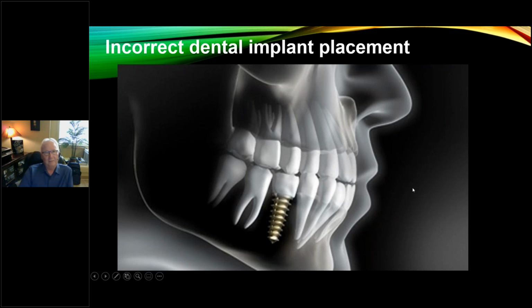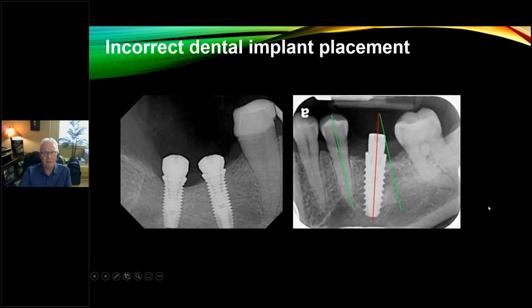All right, incorrect implant placement again, and this is more of an angulation problem. I took these off the internet. I didn't do these. I didn't get these sent to me, but I know enough to know that those 2 implants as they emerge don't have the appropriate orientation, the emergence profile of the restoration. When you restore this and restore this, you can't do it from this case.